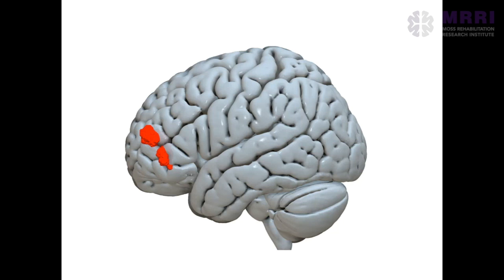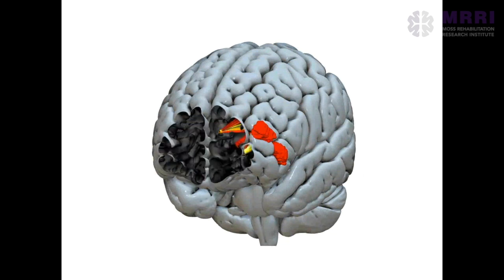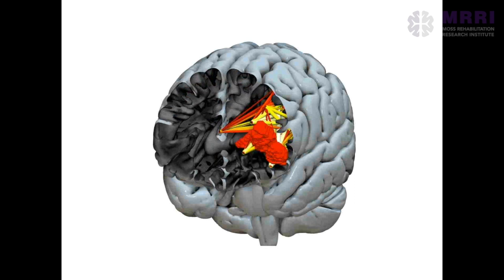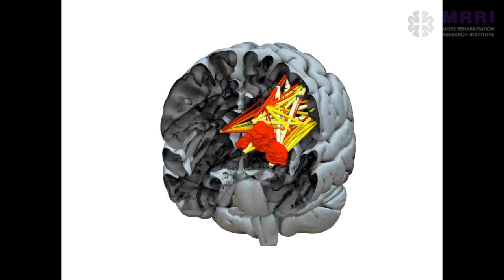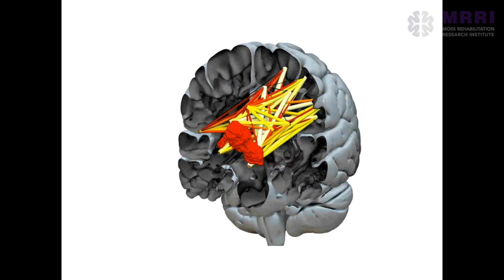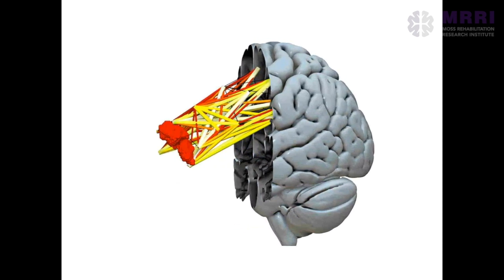You can represent this lesion in the surface space like so, and then what you can start to see with the approach that we get is that even small lesions have large disruptive patterns, given their proximity to major white matter tracts. In this case, this patient who has a frontal lesion actually has disconnection that cascades all the way posterior into pre and post central gyri, okay?